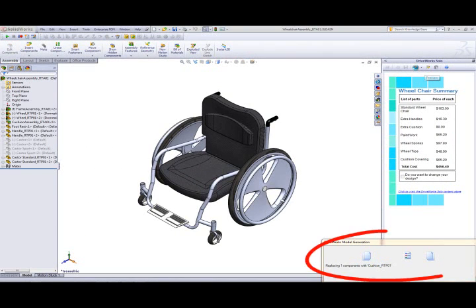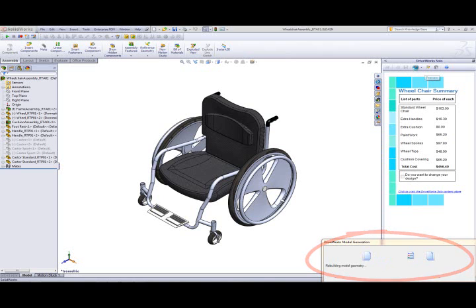As the model is generated, the model generation window displays every action DriveWorks Solo has taken and provides a running commentary on what is happening.